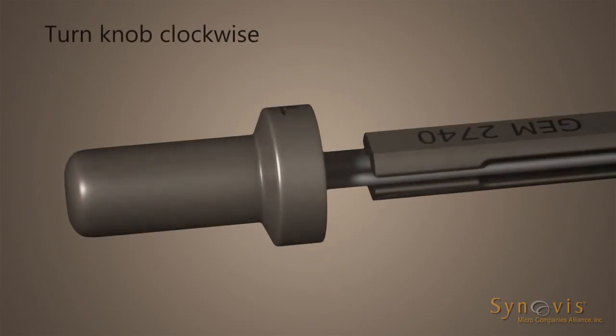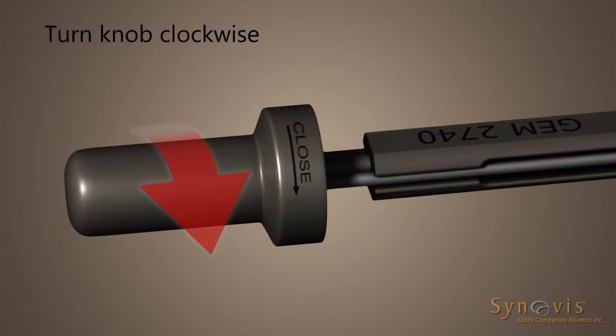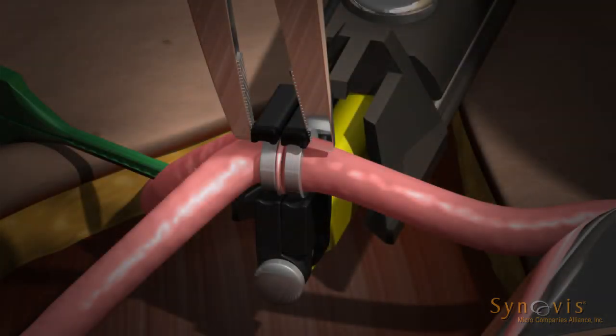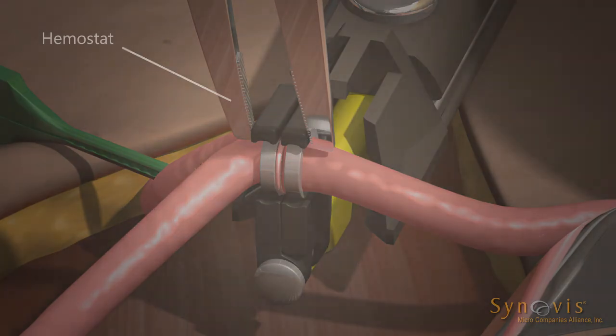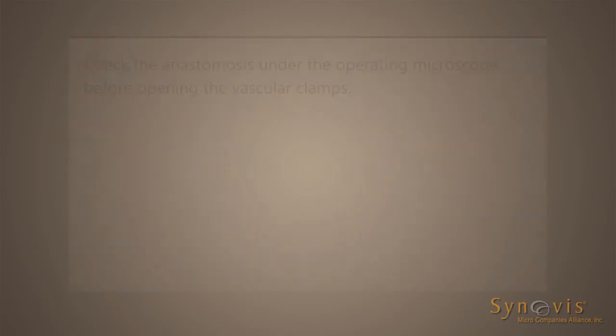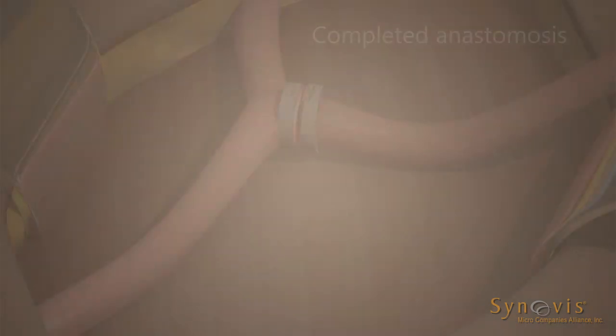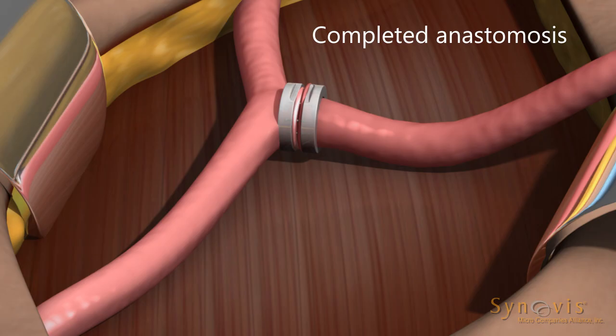Bring the rings together by turning the anastomotic instrument knob clockwise, turning only until the ejector rod has just started to move the now joined rings. Before ejecting the joined rings, gently squeeze the end of the opposed jaws with a small hemostat to ensure ring approximation and a tight friction fit. Check the anastomosis under the operating microscope before opening the vascular clamps. Remove the clamps and inspect the anastomosis to confirm that it has been satisfactorily completed.